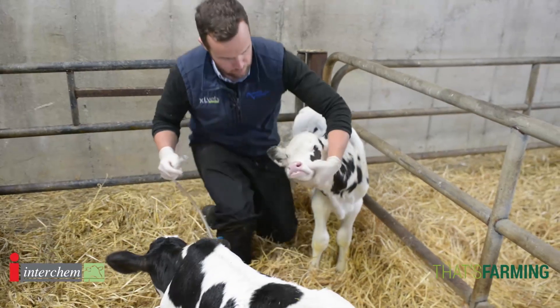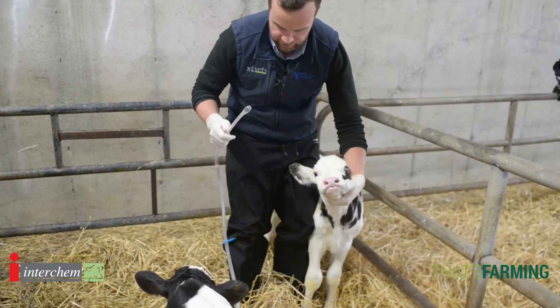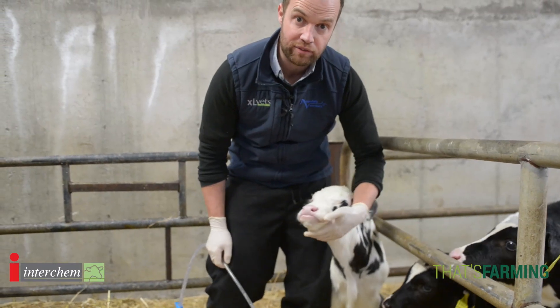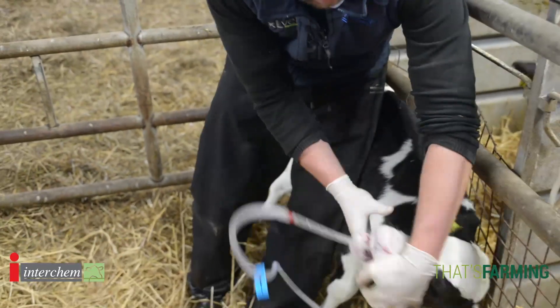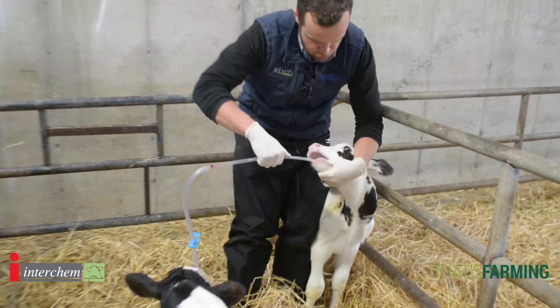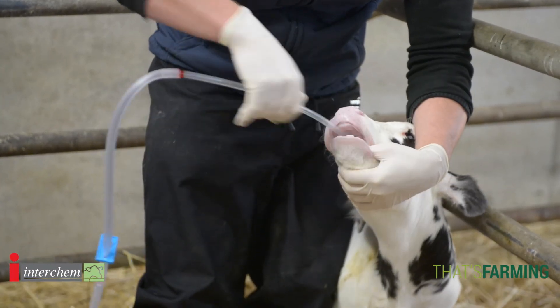When we go stomach tubing, we restrain the calf — I generally will back them into a corner. The more struggling you do with a calf the more difficult they can often be, so if you're relaxed with a calf it's better. We gently pass the stomach tube over the tongue to a point where they swallow.